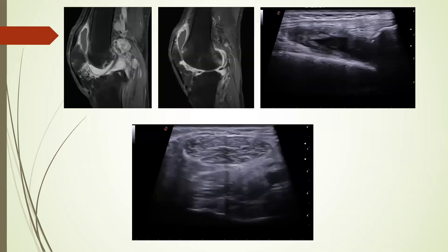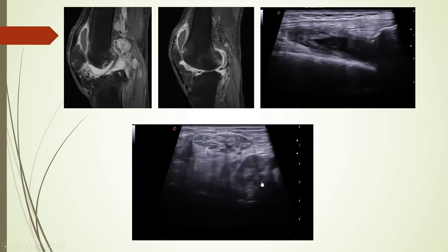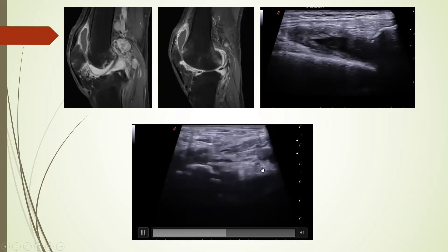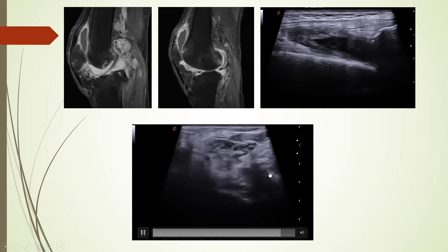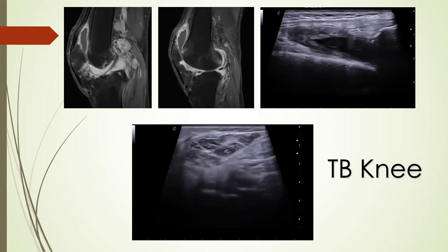In this case we can see synovial thickening, effusion, and enhancement, plus lymph nodes in the popliteal region. This still ultrasound image shows surrounding synovial thickening with effusion, and in this popliteal region ultrasound video we can see enlarged lymph nodes. This was a case of infective arthritis of the knee joint, particularly tuberculosis.